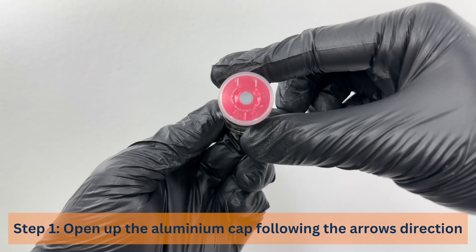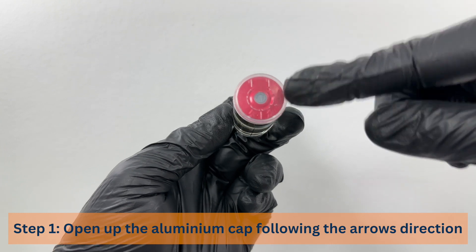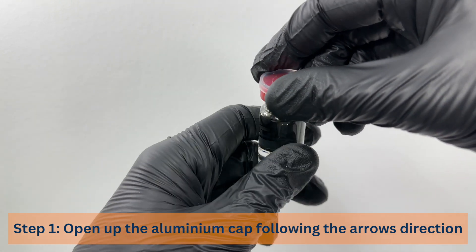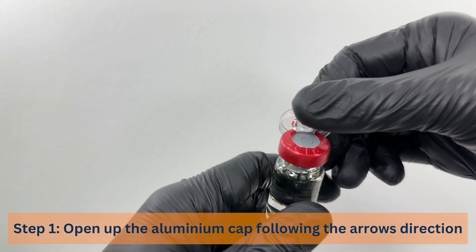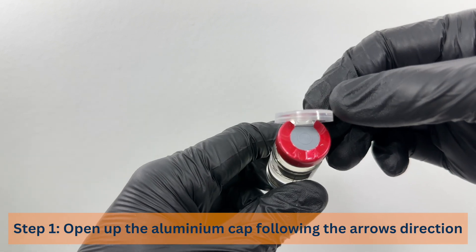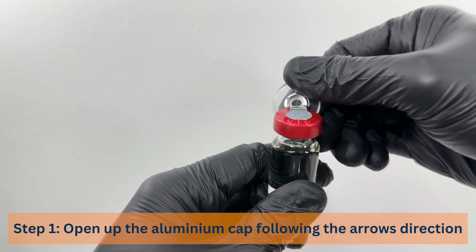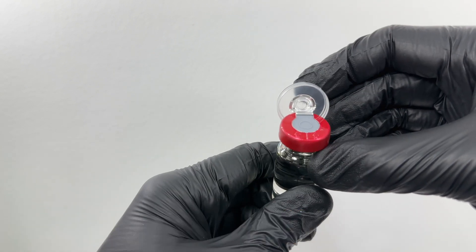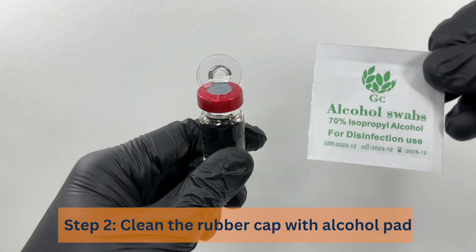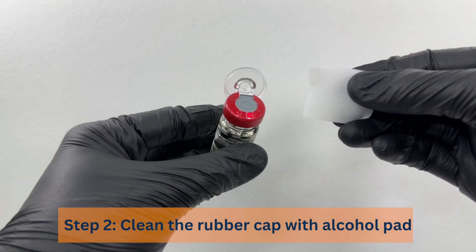Step 1: Open the aluminium cap following the arrows direction. Step 2: Clean the rubber cap with an alcohol pad.